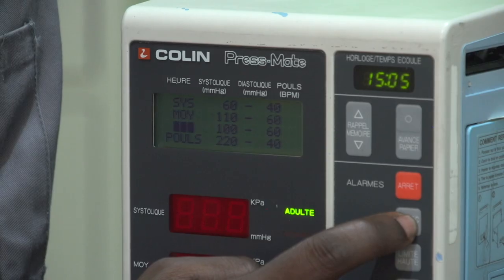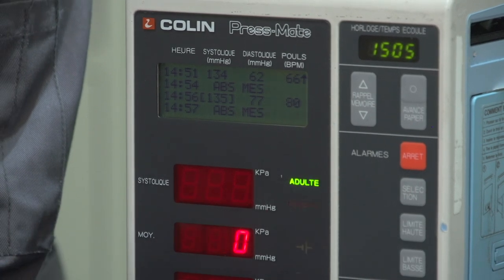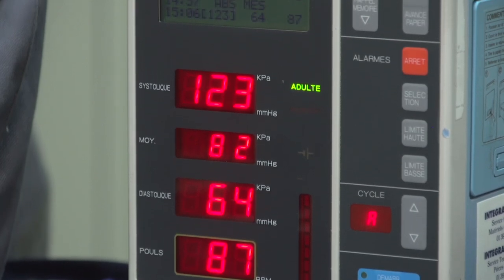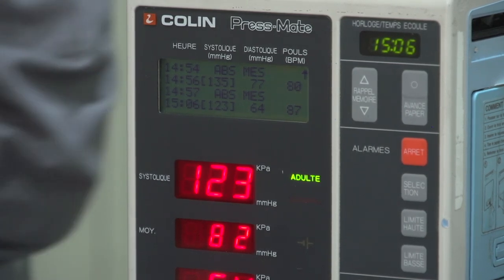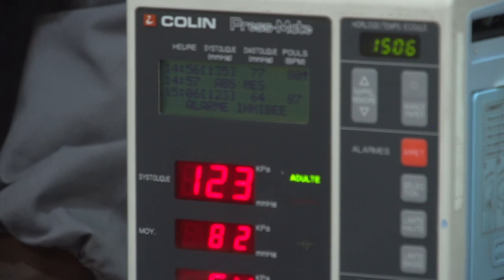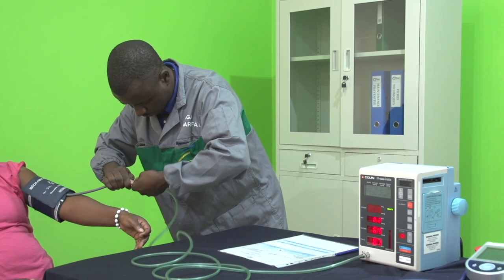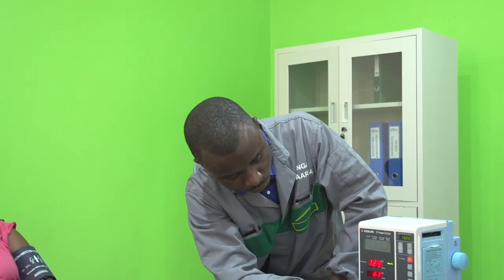On va vérifier le fonctionnement des alarmes. On va dans les réglages d'alarme pour régler le seuil haut de l'alarme de la pression systolique à une valeur inférieure à notre propre pression systolique, et on vérifie le déclenchement de l'alarme PNI haute. De même, on règle le seuil bas à une valeur supérieure à notre propre pression systolique et on vérifie l'alarme PNI basse. On fait de même pour les alarmes hautes et basses de la pression diastolique et de la pression moyenne. Attention : on n'oublie pas de remettre les seuils de toutes les alarmes à leurs valeurs d'origine. La dernière alarme vérifiée est celle qui se déclenche quand on débranche le brassard et qu'on lance une mesure — une alarme indique que la mesure est impossible.